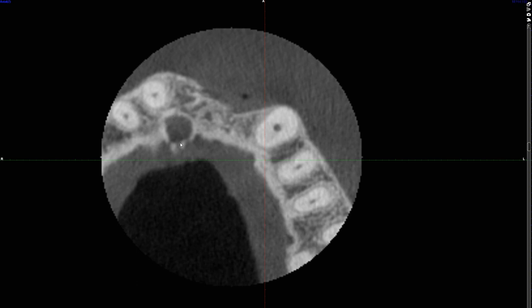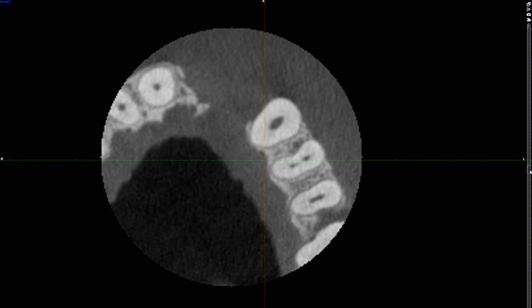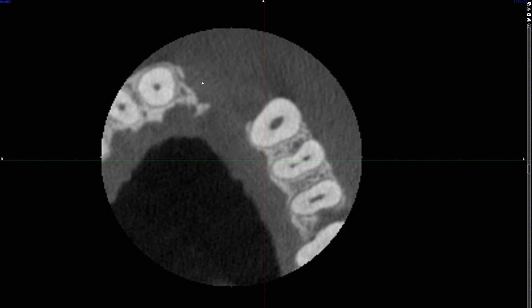This is the nasal palatine canal, which makes this number 8. Number 9 is missing. Number 10 is missing. We have 11, 12, 13. For those watching carefully, you may have seen that there are two canals — that is another feature suggesting this is the first premolar. Also look at the shape of the canine: much wider and bigger compared to these two. So that is another clue — this is the canine. We have two premolars, therefore the lateral incisor and central incisor number 9 are missing.